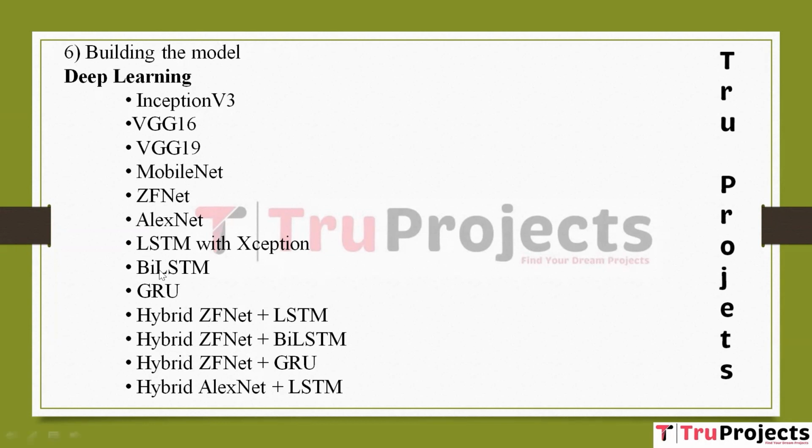BiLSTM, Bidirectional LSTM. BiLSTM is a variant of LSTM that processes data in both forward and backward directions. This is particularly useful for capturing bidirectional dependencies in sequential data. It can be applied to analyze ECG data for sleep apnea detection.